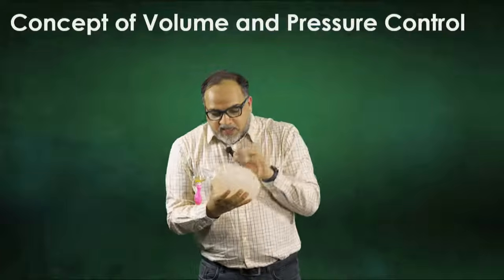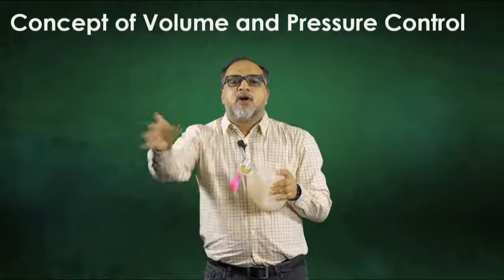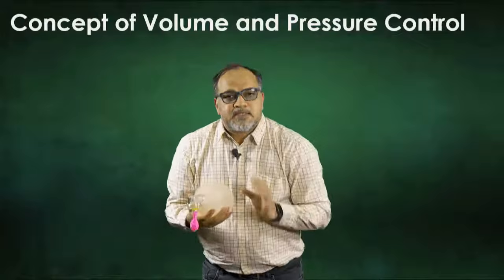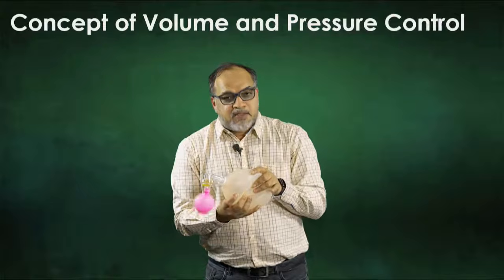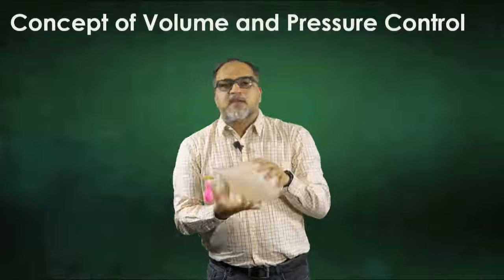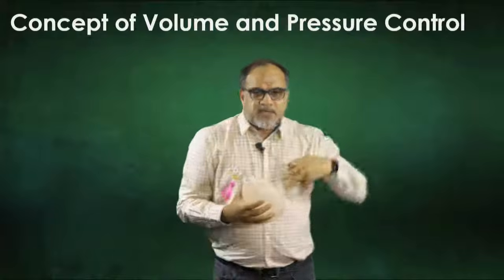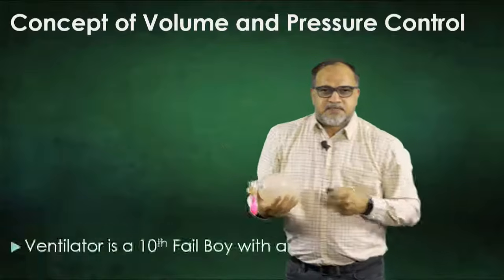Agreed? In one case, I'm controlling the volume and pressure is in God's hands, or let's say scientifically, pressure depends upon the compliance and resistance of the patient's lungs. In another case, we are controlling the pressure. We are not letting the pressure rise above 30, and whatever tidal volume is generated depends on God's hands, or let's call it compliance and resistance. Are you with me so far? If you are, then please write yes.